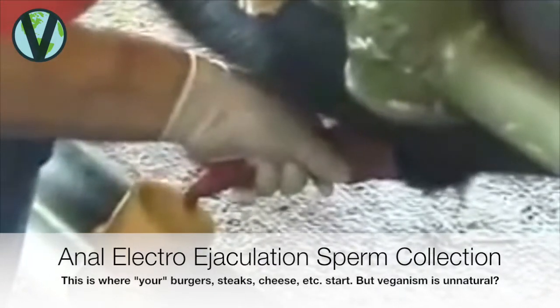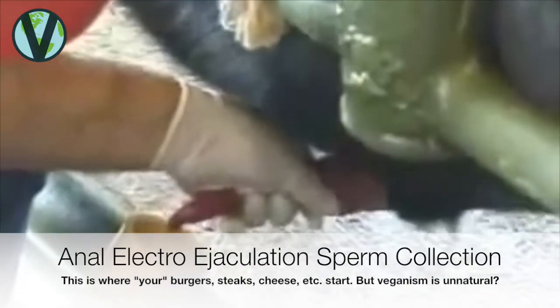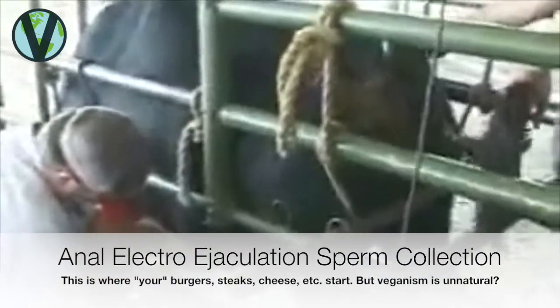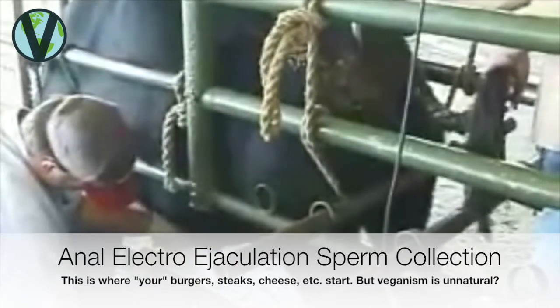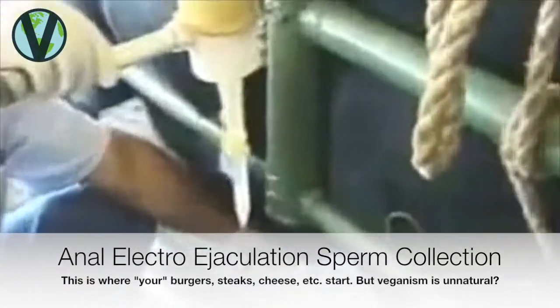And actually this stimulation, if you were to put your hand on the probe, you could hardly feel a little bit of the stimulation that's coming. The pelvic area is very sensitive, and that's why you see the strong contractions of the bull here. The collector will continue to stimulate that area until he feels he's got a good collection.